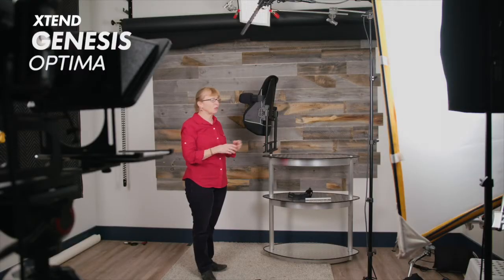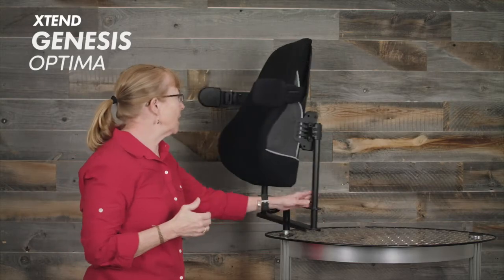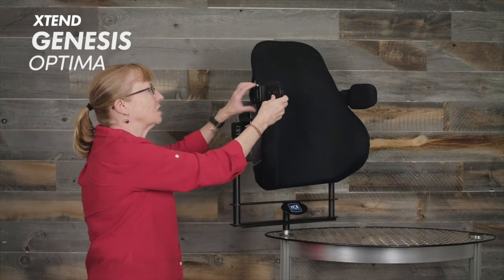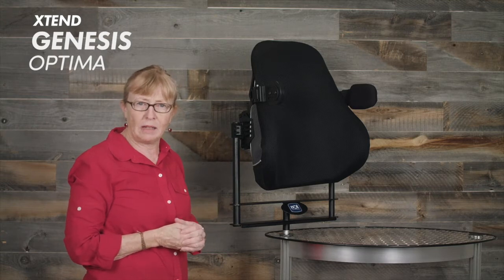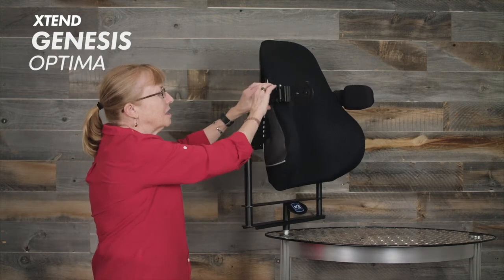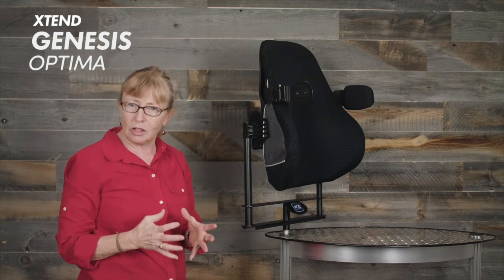We have a fixed short arm with a small or large pad. We also have a swing away arm — if you need it to swing away, you can do a swing away arm, which also comes with either a small or large pad. And then we have a swing away that is extendable, which only comes with a large pad.